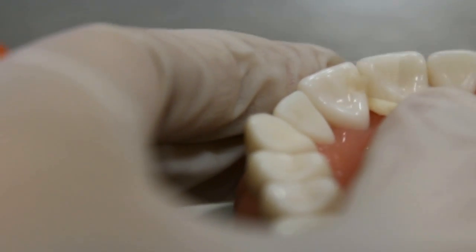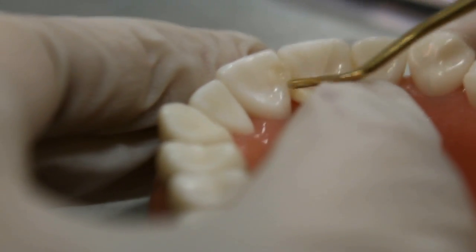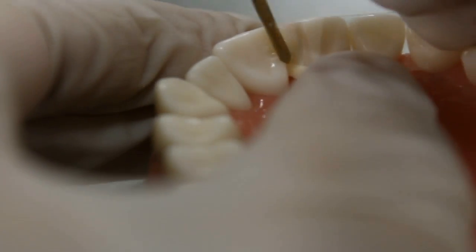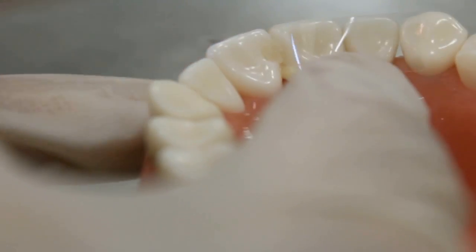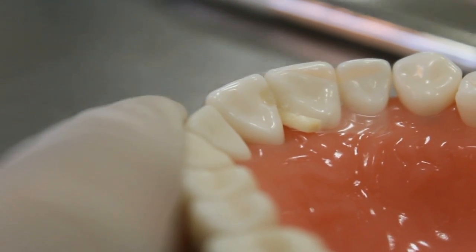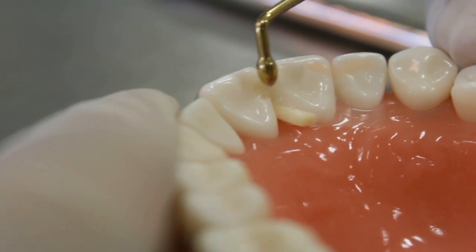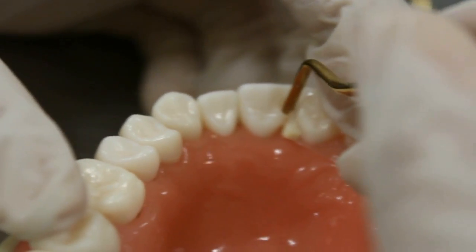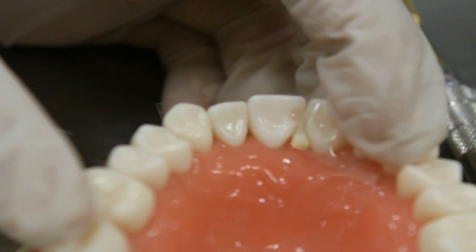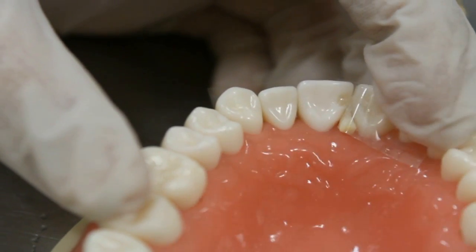Place the composite using the gold instrument. Try not to take large increments and remove all the excess. Try to contour it and find the instrument that is suitable for your situation. To avoid spending time contouring the proximal area after curing — which is really difficult — try to use a transparent matrix during the cure of the composite.